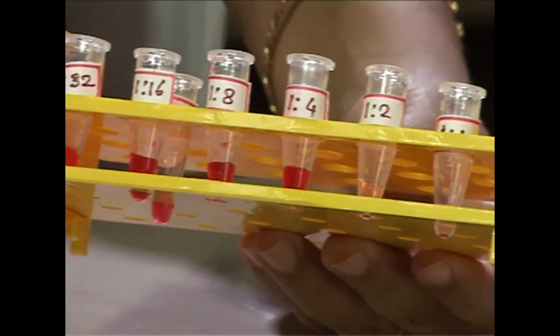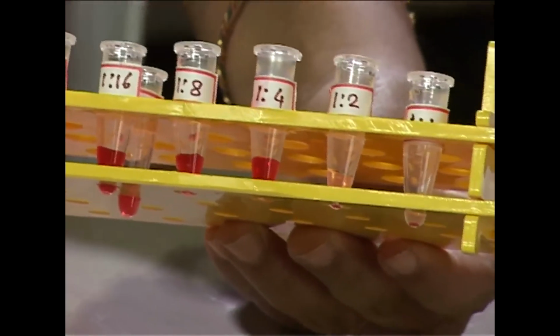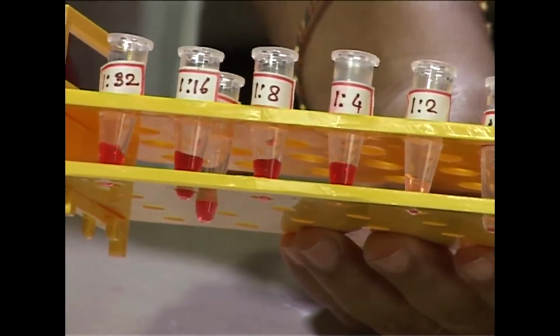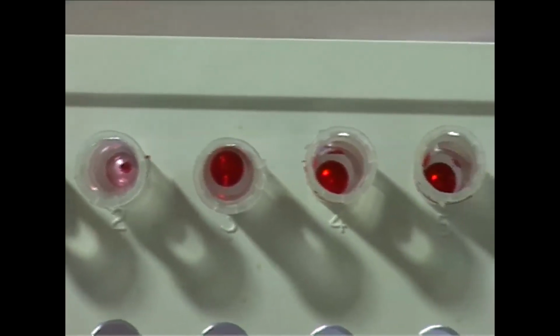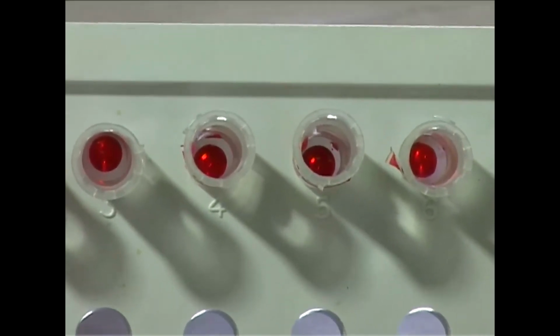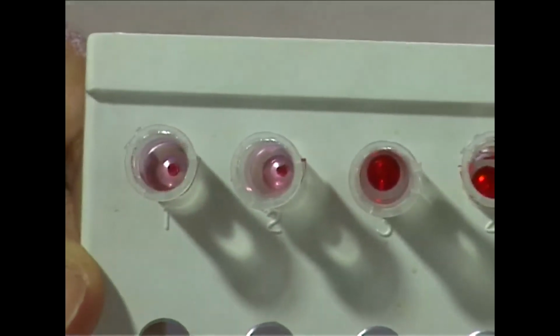These are the tubes where hemagglutination assay has been done. Looking at the wells, we can say which one shows a negative result and which well shows a positive result. These are the wells where the hemagglutination reaction has taken place, and these are the wells where RBC concentration was more and a red button has been formed at the bottom of the tube.